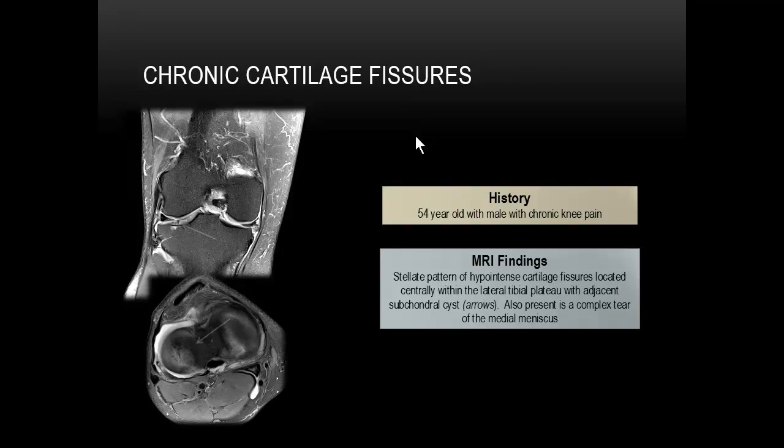So being able to understand the chronicity is also helpful in putting this into clinical context. If this patient was presenting with a 3-week history of pain, we can be relatively assured that this really has nothing to do with their symptoms.